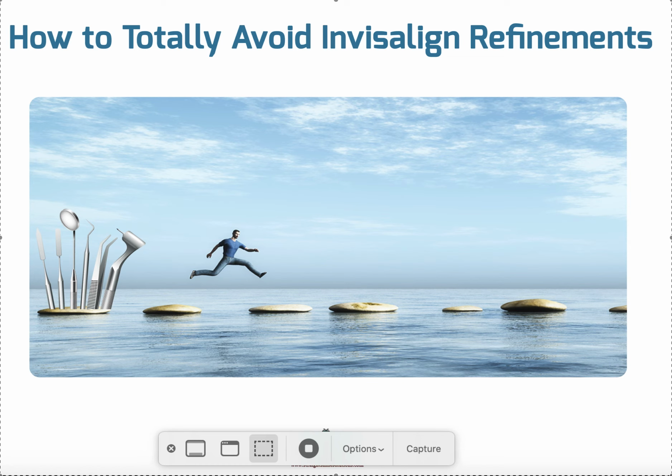So anyways, hopefully this was helpful. I think once you start to get this, it'll blow your mind. It'll totally transform any frustration that you have with your aligner treatments. But I think the biggest mistake most doctors make is that they just like, oh, here's 5 trays, wear them each for a week, I'll see you in 5 weeks. Oh no, that's not gonna work.